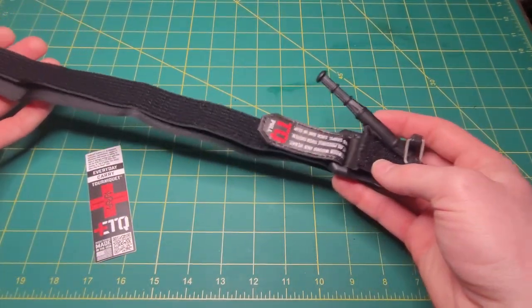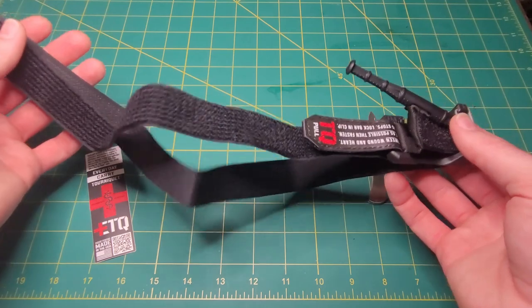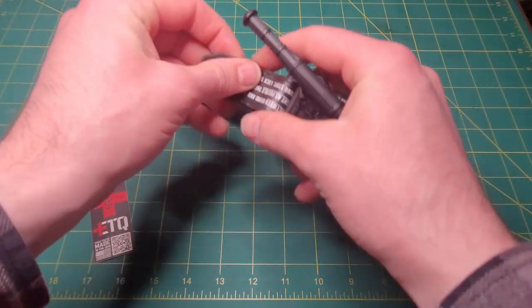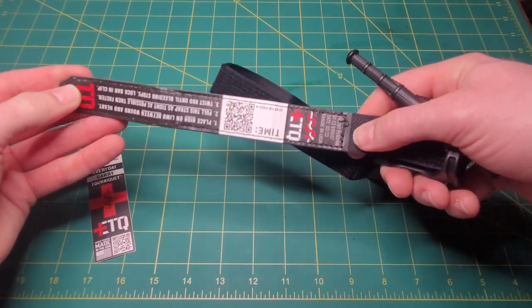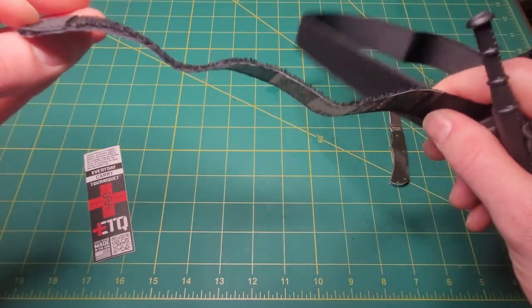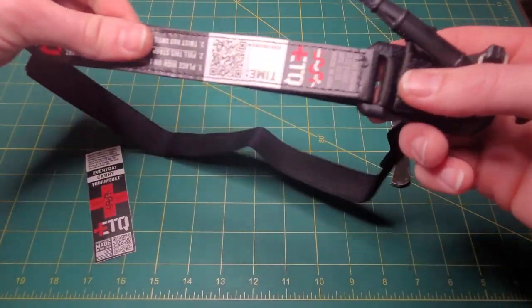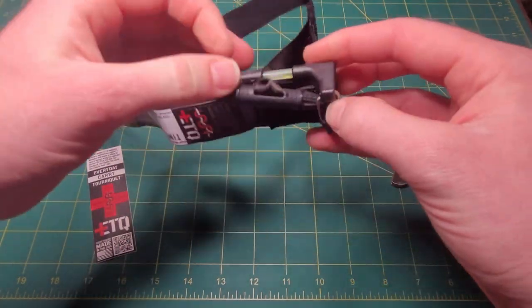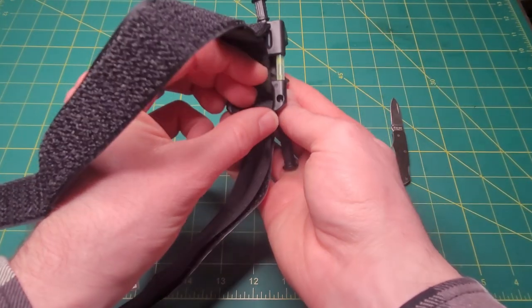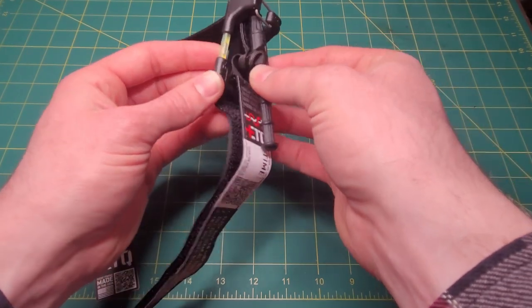A couple things I like about it: I like how small it is — it just feels extremely lightweight. I like the instructions they provide on this tab, and they've got the QR code for how to use it, so that's nice if somebody else has to use it and doesn't have training — they can still operate it. Something I don't really like is this glow stick they have, which they sell replacements for on their website, but it just kind of seems impractical.